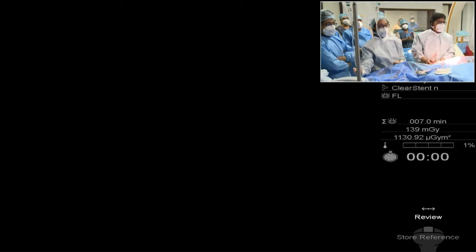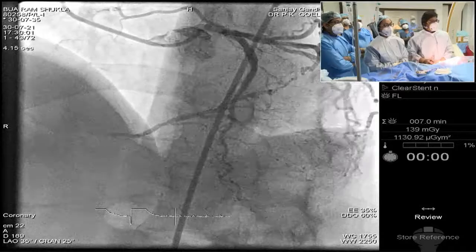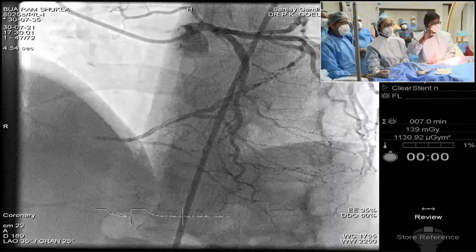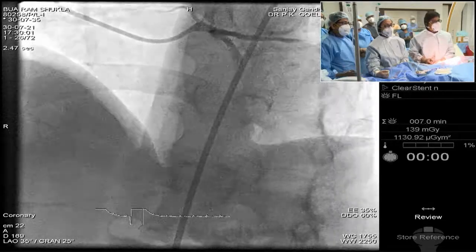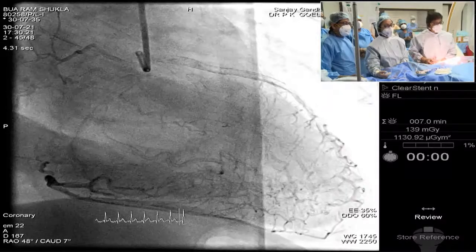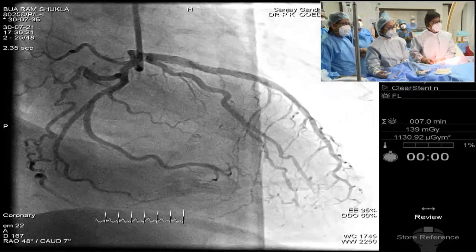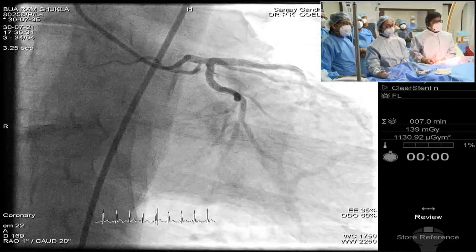Next. So with that point, I think we decided to do the RCA, and so that's how he is here now. I would just show you the current angiograms so that we ensure that the LAD that we did is fine, because that's the most important thing. So that's the left injection, so the LAD looks fine, and there are some collaterals that have come up through the septals. Now you see that? Very nice. They have come up through the septals also. Yeah. So we have that option in case. You have some distal collaterals which are actually not jailed by the stent, which are highly favorable. So you've really opened up a lot of options here.